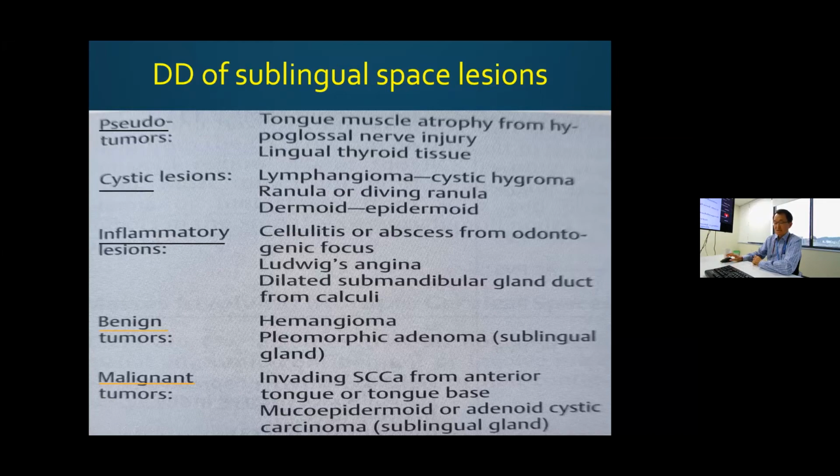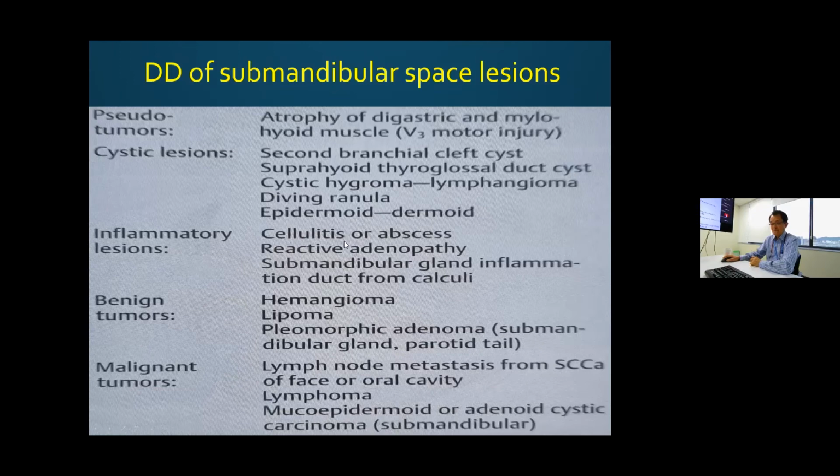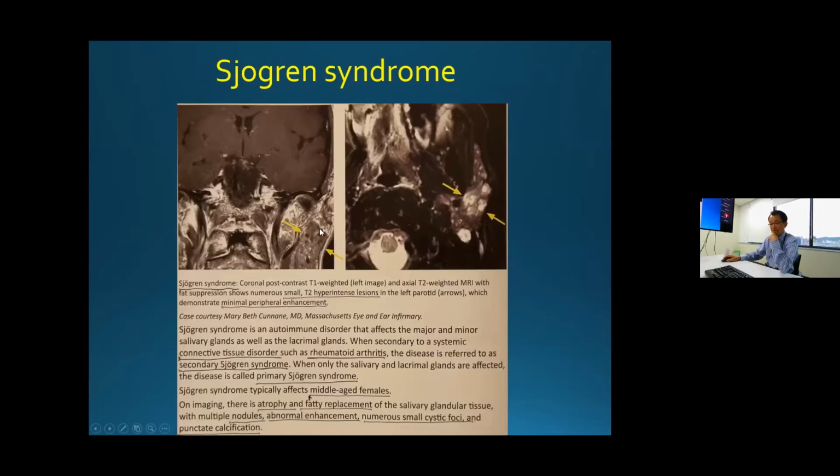Sublingual, just under the tongue, that has also benign and malignant tumors, but it's rare. Submandibular tumors include mucoepidermoid carcinoma, adenoid cystic carcinoma, and then benign pleomorphic adenoma. So the mandibular space: here, the mandible on coronal and axial shows a certain irregularity.